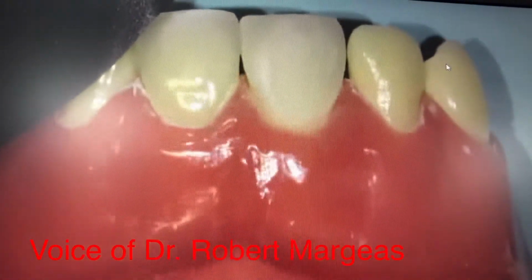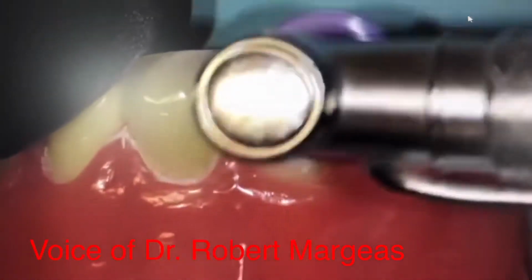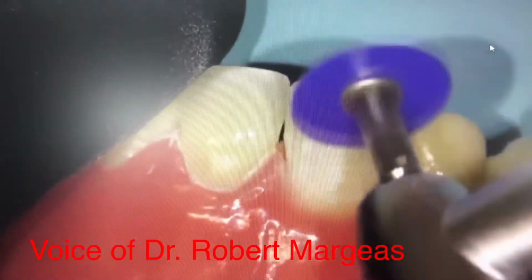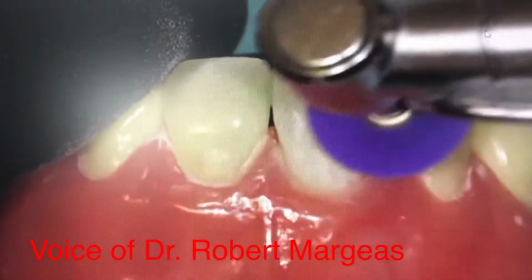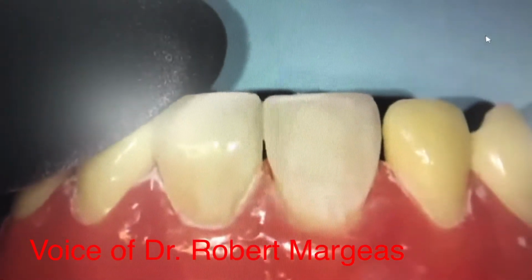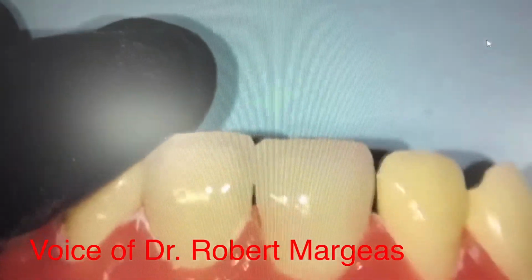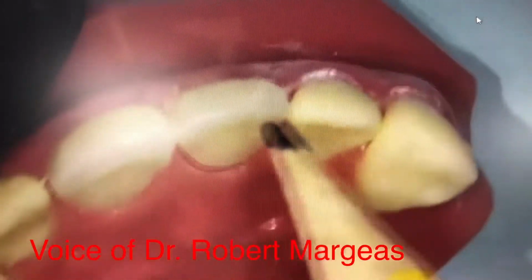And then after I start to do this, I'm going to build my line angles in with a pencil to show you how I create that. I just get a little bit of a matte finish to begin with. Okay, and my assistant always has a wet gauze to wipe that excess off. So the first thing that I do is I like to line up this.